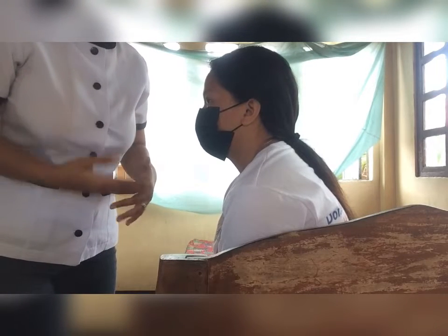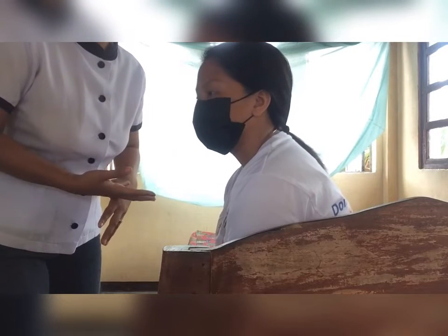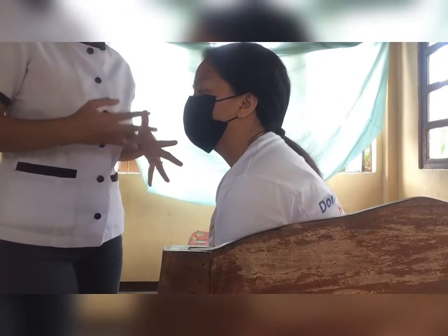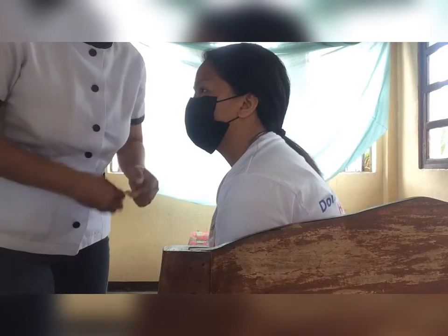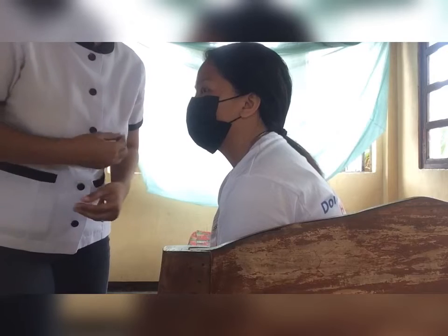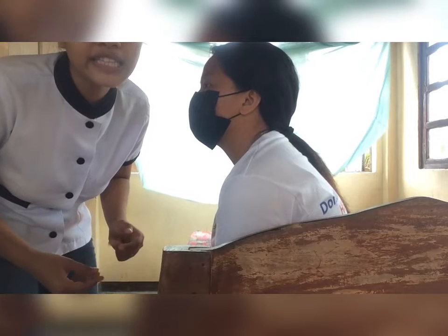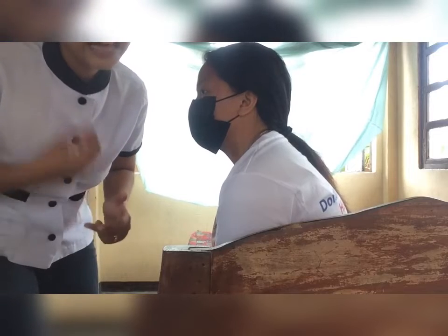Then maneuver the speculum until you can see as much of the eardrum as possible, and note the color and contour of the eardrum, because normally the tympanic membrane is pearly gray and semi-transparent, while abnormal colors are red, yellow, blue, or a dull surface.